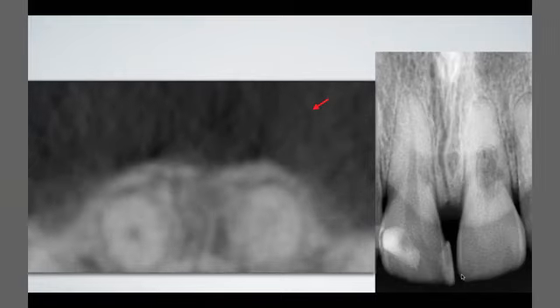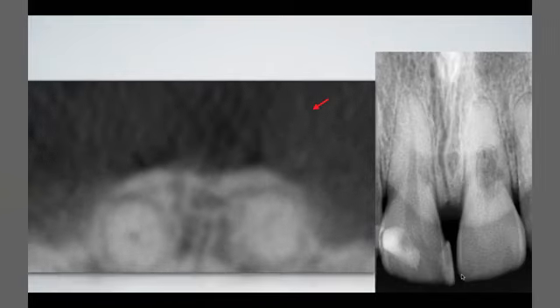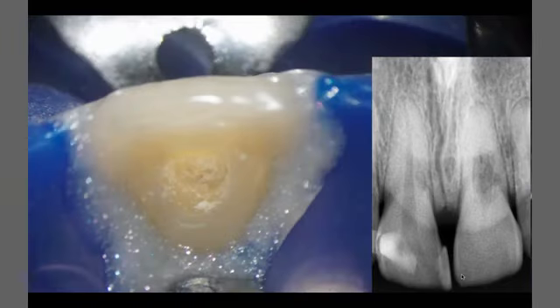That's why we can do the normal root canal treatment and the filling, maybe with gutta-percha and sealer, because there is no connection with the periodontal. When we have a connection, we can do the operation with another biocompatible material, MTA, Biodentine, or bioceramics.